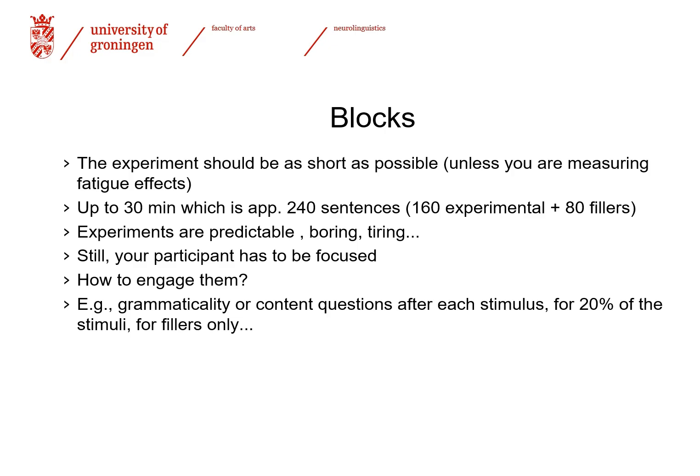So let us say that a student without any language or reading problems should be able to do a sentence processing experiment, so read sentences for something like up to 30 minutes. This is approximately 240 sentences, which should be enough for a relatively large experiment with 4 conditions. Everything after that is already going to cause some strain. It's not impossible, but it is absolutely not desirable.